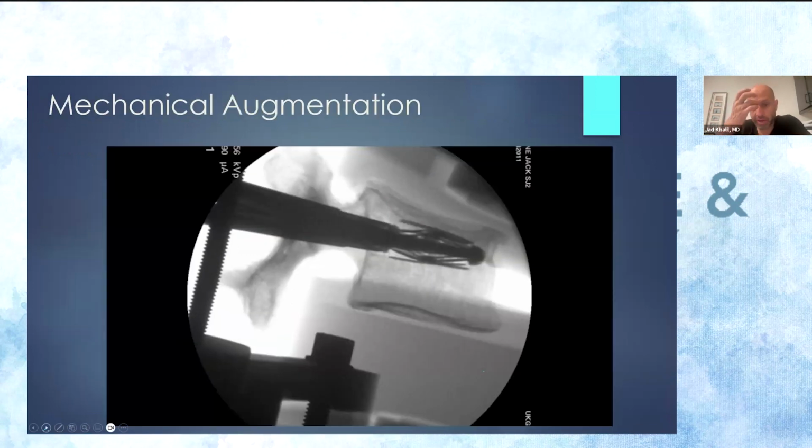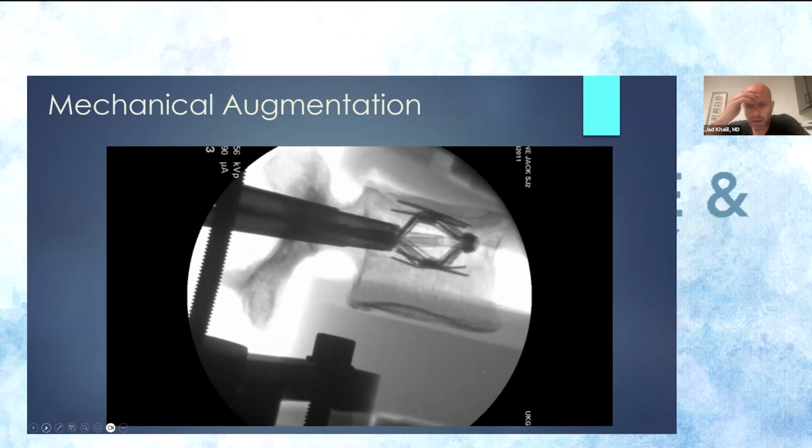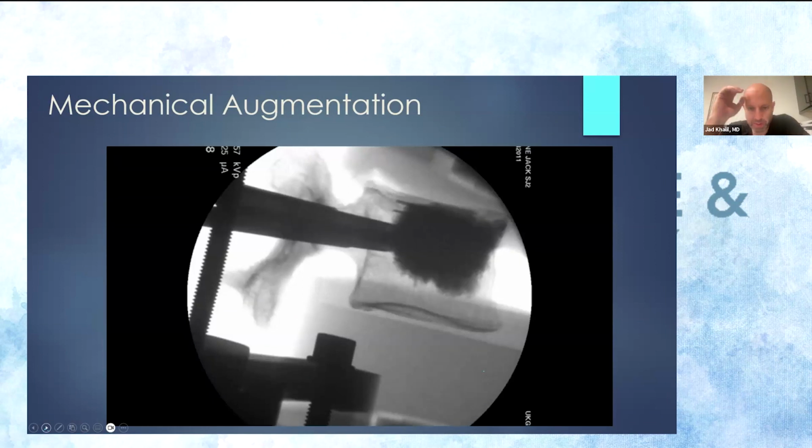And sometimes this video works and shows gentle expansion. So I always say gentle bipedicular expansion. You'll see the end plate pop like so. And then you don't remove anything, you just keep everything in place and start injecting cement also slowly under multiple shots. This is not the time to save radiation.